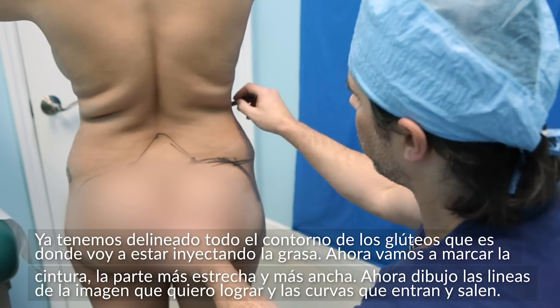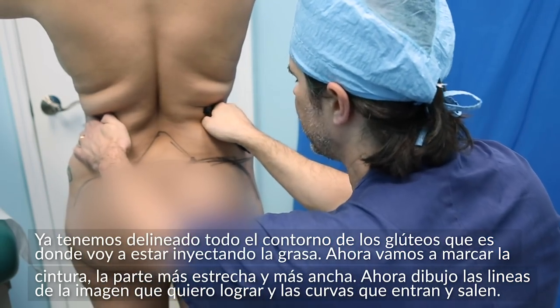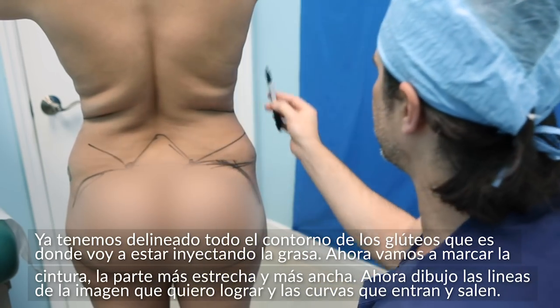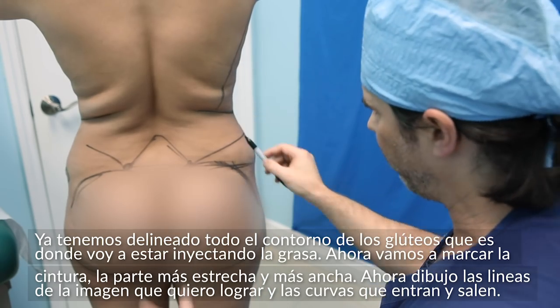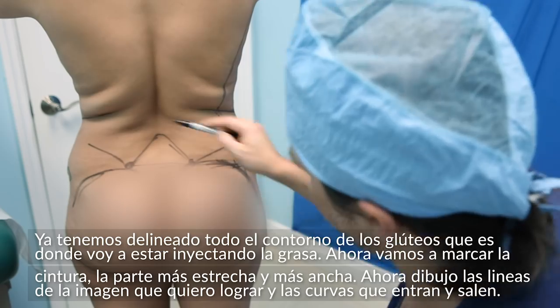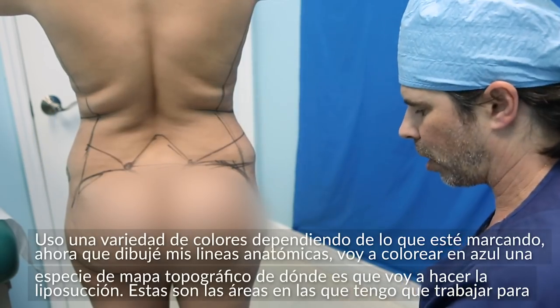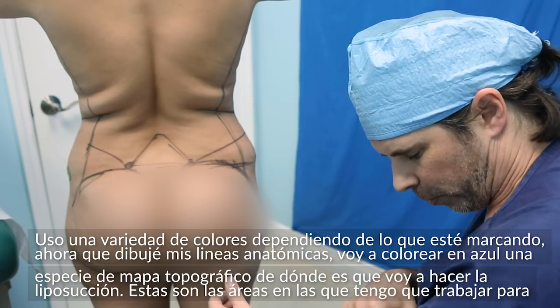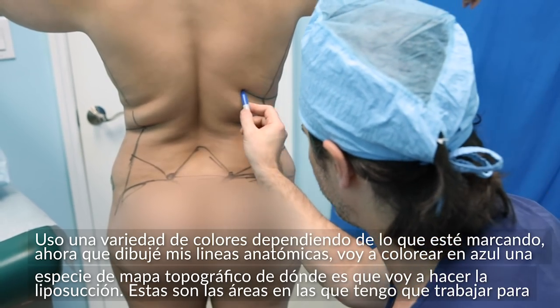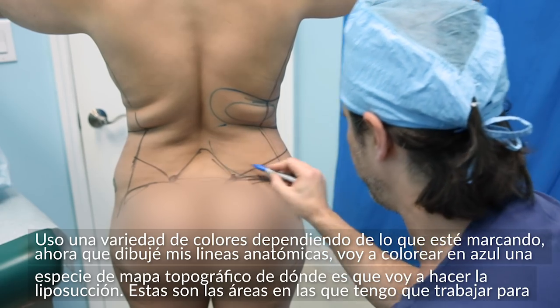Now I'm going to see where her waist is — the portion where her waist comes in the thinnest and the narrowest. Then I'm going to create my lines and draw my visual shape in my head. After I draw my anatomical lines, I'm shading in a little topographical map of where the liposuction is going to be.